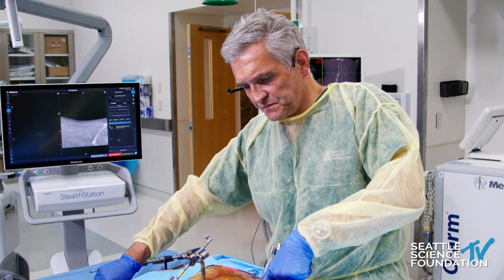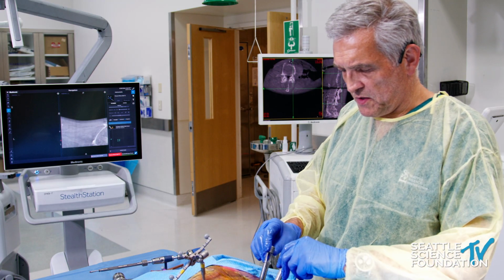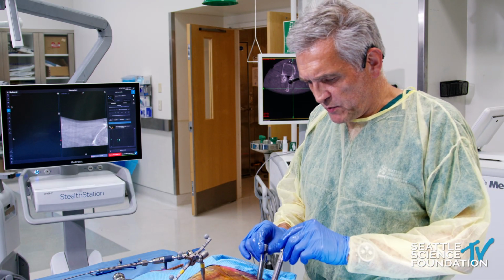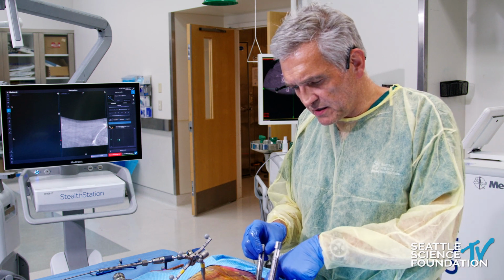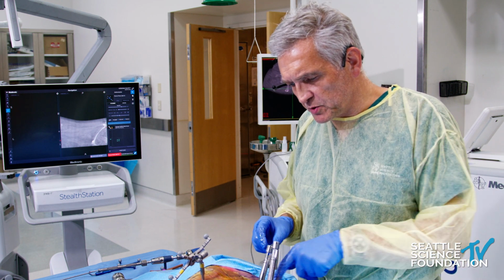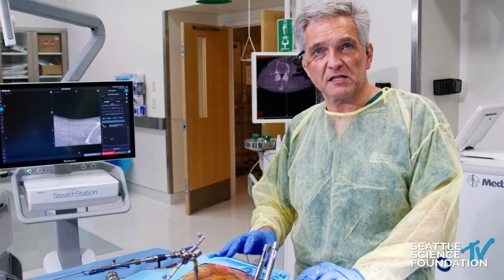And then when you close up, obviously, you've got to make sure the multifidus muscle is here in the middle. So you don't want to push that muscle down when you put the rod in. You've got to go underneath the muscle.